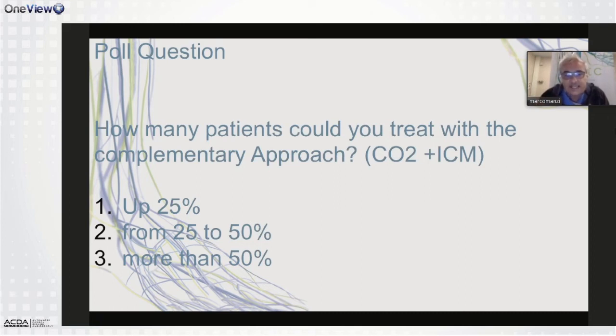But the picture of the reality, I don't know, because it's very important to realize that the integration of contrast medium with CO2 is really useful and probably in some situations could not be avoided, but could be reduced very well with the experience and with the training we have when we use this technique every day. Of course, when we arrive to use CO2 and contrast medium in more than 50% of patients, it could be a first step to arrive to a zero-contrast procedure, which could be the ideal target in our everyday practice.